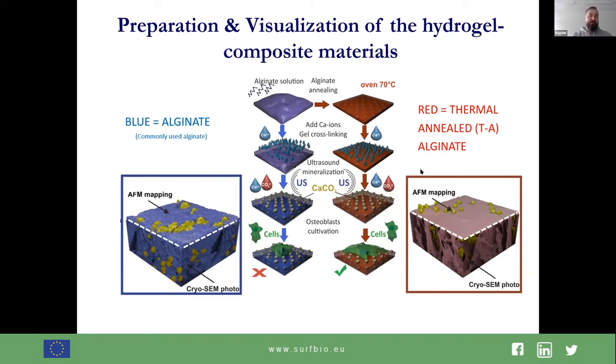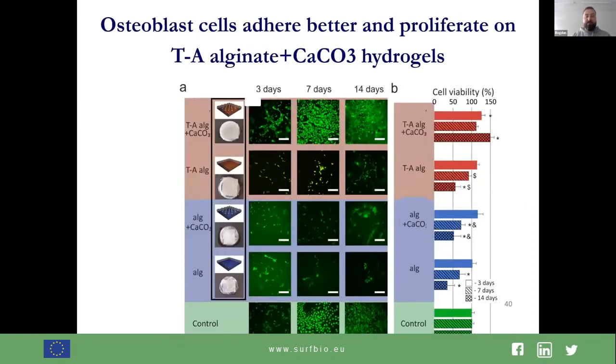Why do we need such a strange procedure, like preheating the gels, to do synthesis exactly in it and grow cells, but it doesn't work, for example, when we just take gels, not preheated, and don't add the particles? We do this analysis and understand, okay, really it is just the combination of thermal annealing of the gels and adding the particles that works well for the cells.